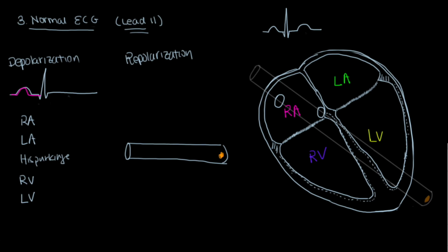And if you have repolarization happening, when we depolarized, things went from here all the way down to here, right? And then we saw the blip going up. So when we repolarize, we want to bring this charge back to where it was before. And so that would mean things are moving away from it, right? So in terms of, this is as time goes on. So as time goes on, as the charge moves from here down to that way, you'll see it go down this way, correct?